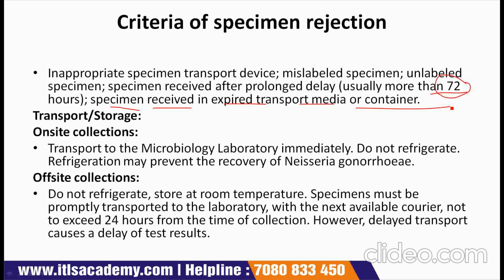If an unacceptable specimen is received, the physician or nursing station will be notified and another specimen will be requested before the specimen is discarded.